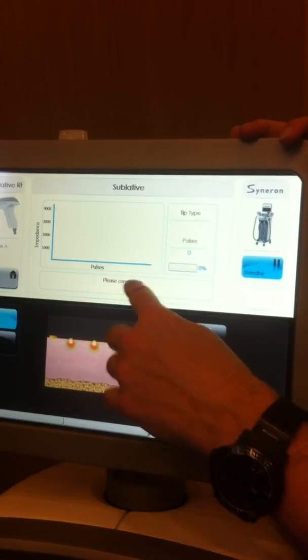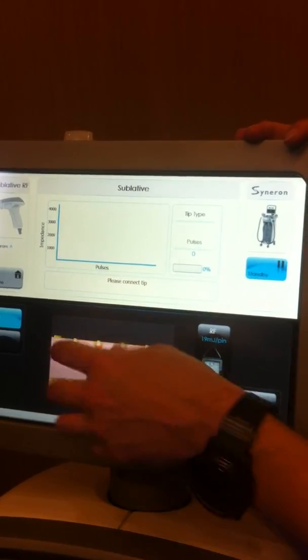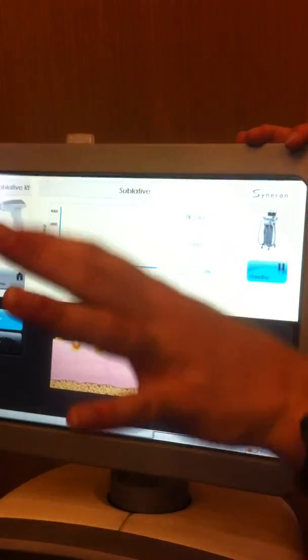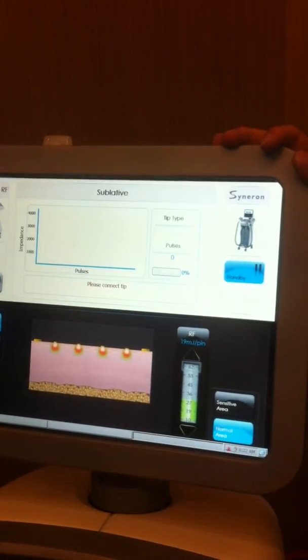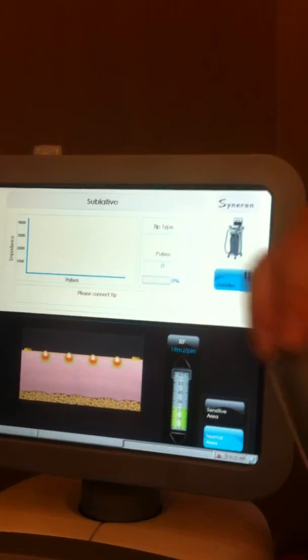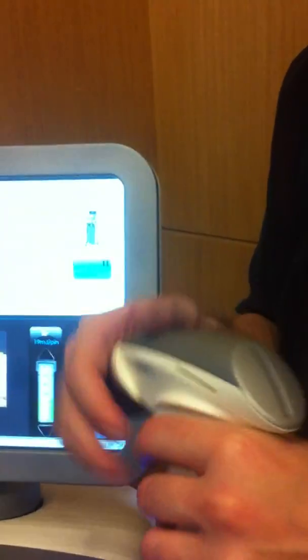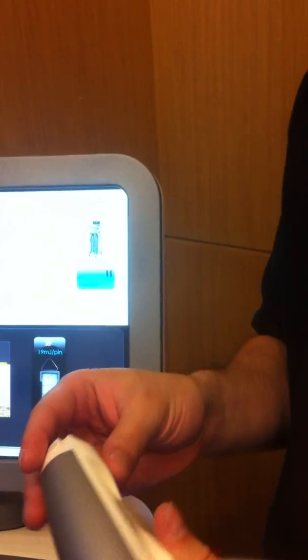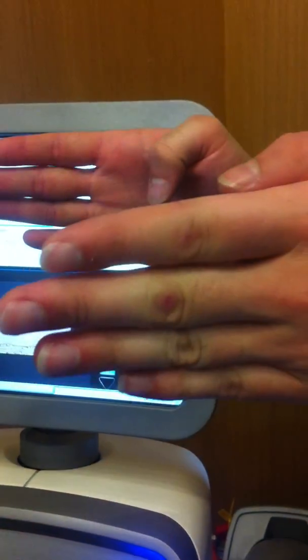Of course, I have to connect the tip. When I connect the tip, you'll notice that this graphic will change depending on the tip that I connect. So if I connect a 44 tip on this, you're going to see that this graphic will actually change and you'll see that the electrodes actually move closer together and the area is smaller.